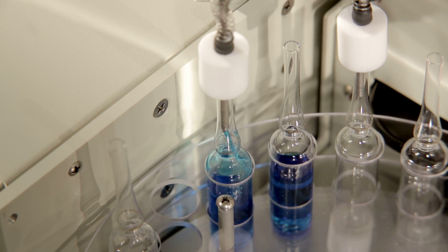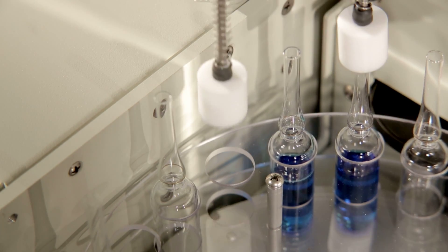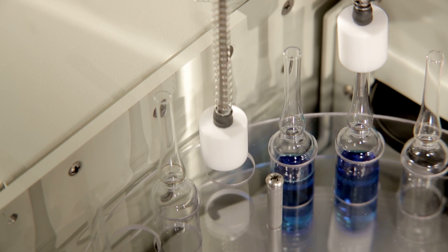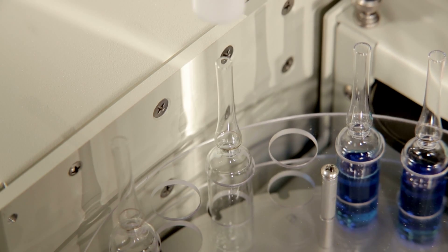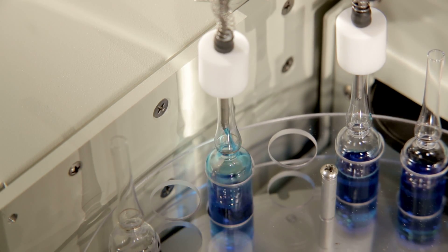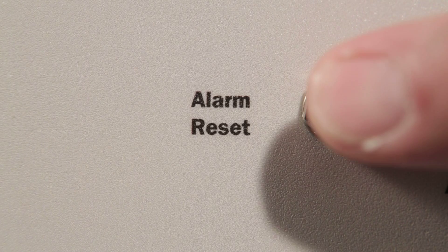If a carousel ampule position was left empty or a batch has reached its end, the plunger will sense this and not dispense any liquid. Injection will only occur when the plunger has detected an ampule is present. If misalignment occurs, an alarm sounds.